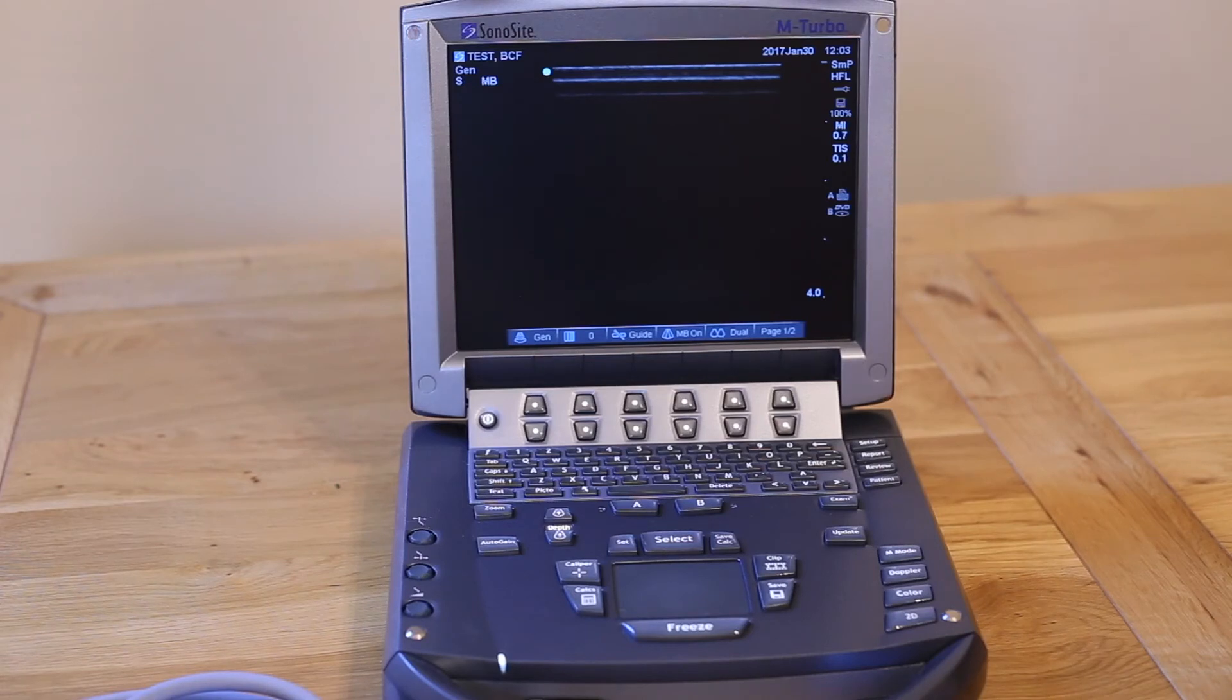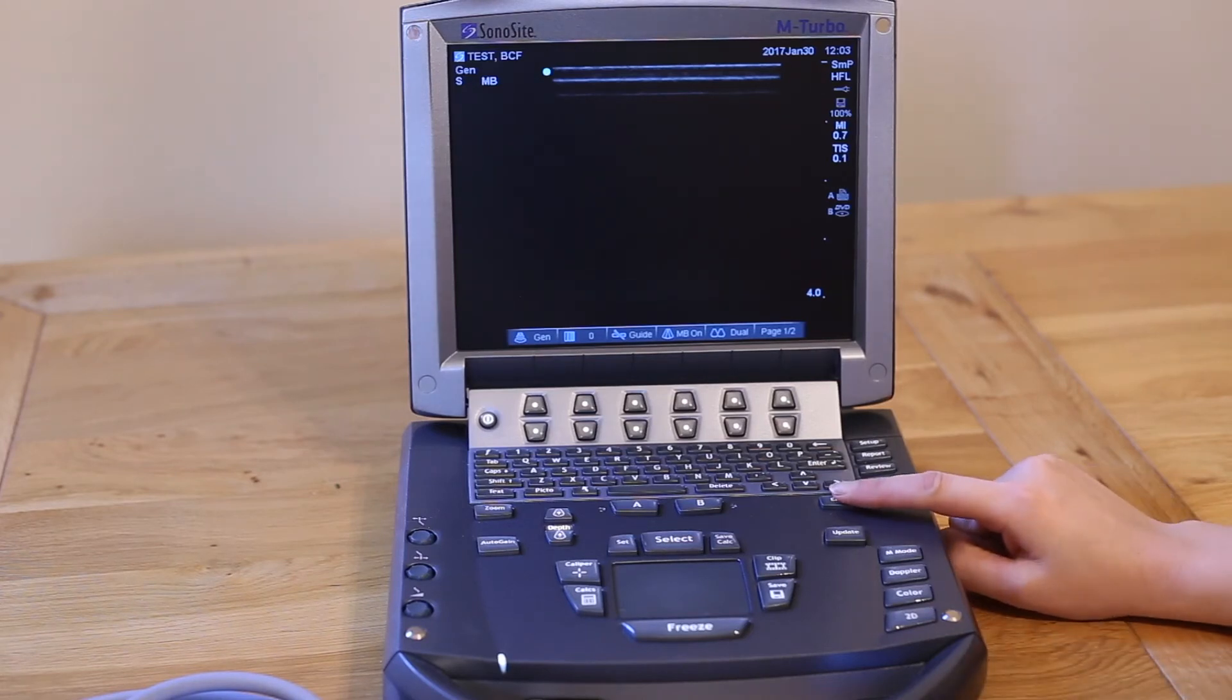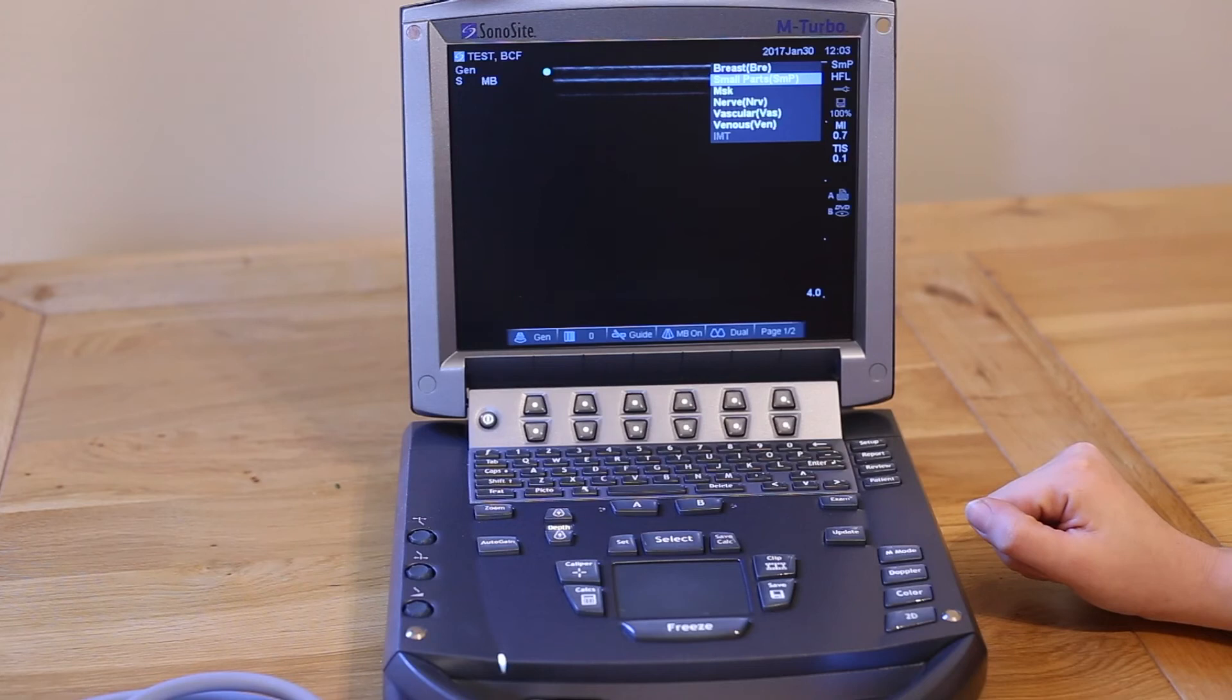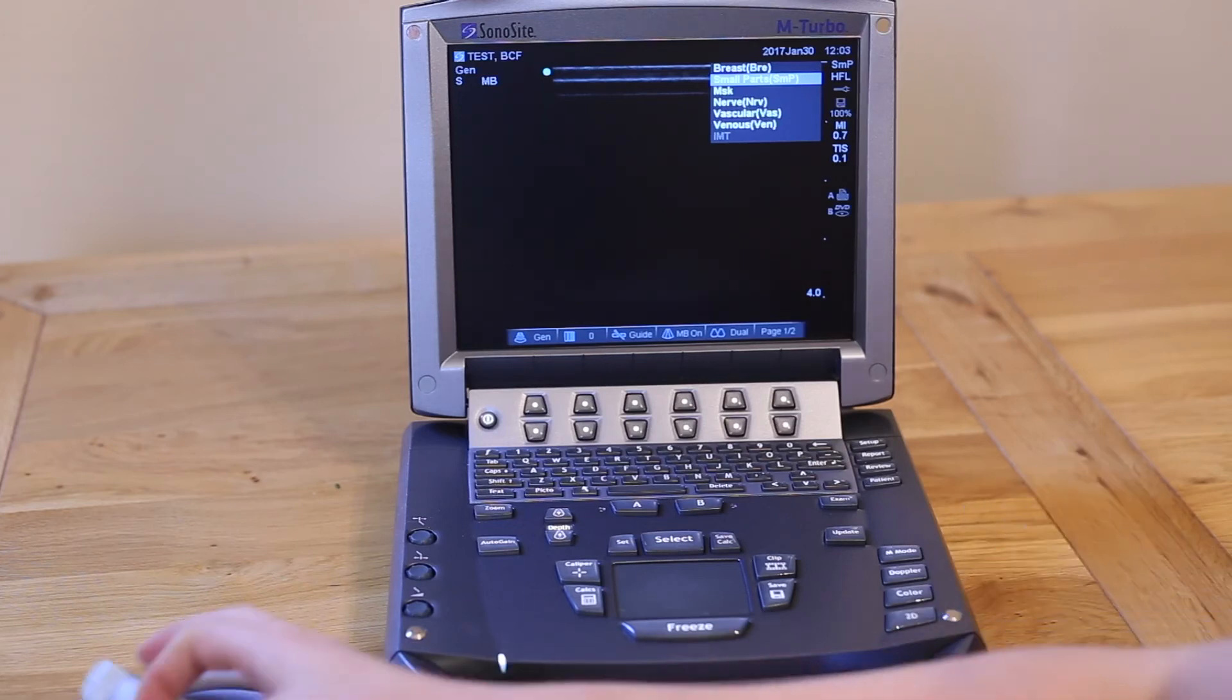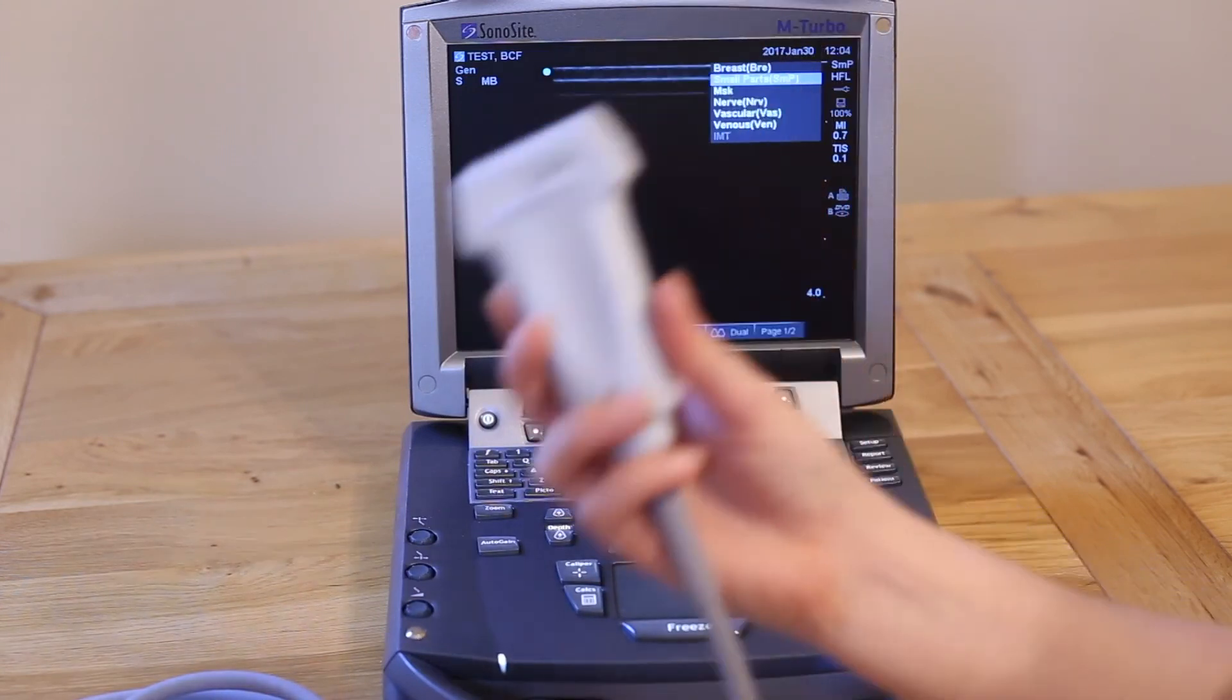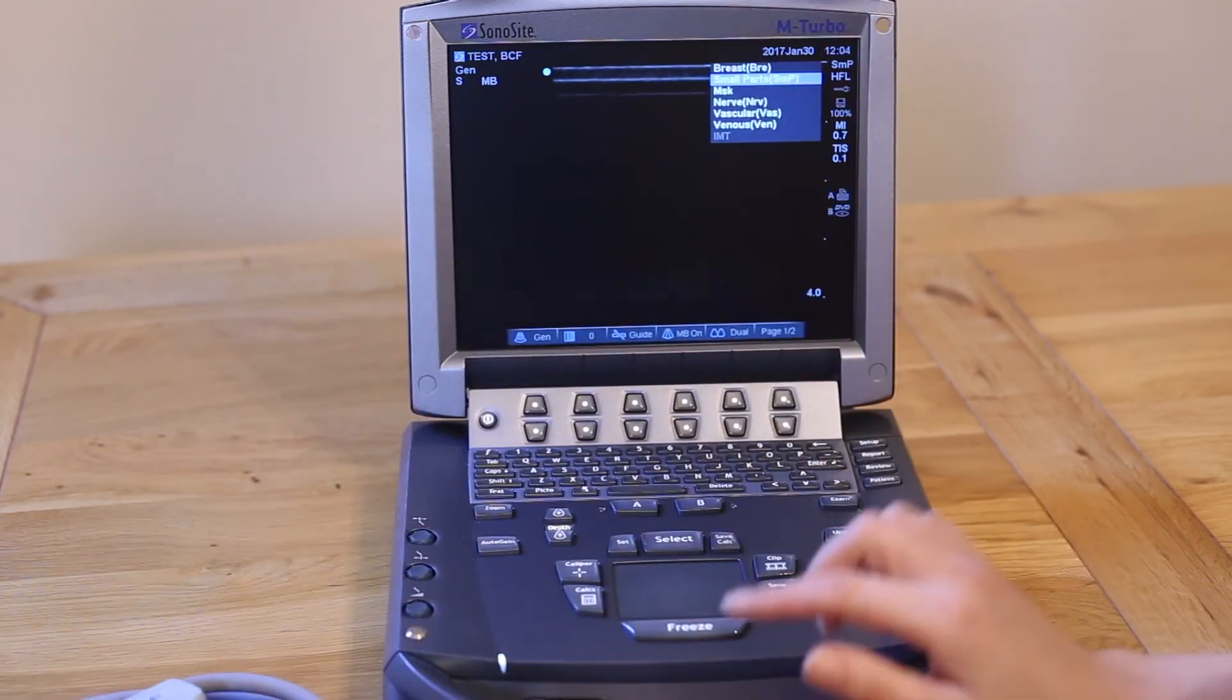To select the most appropriate preset, press the exam key here on the top right hand side of the keyboard. In this menu you will find a list of studies according to the type of probe that is currently connected to the machine. We have a linear probe attached at the moment, often used for tendon scanning. I would recommend SMP or small parts for tendon use.